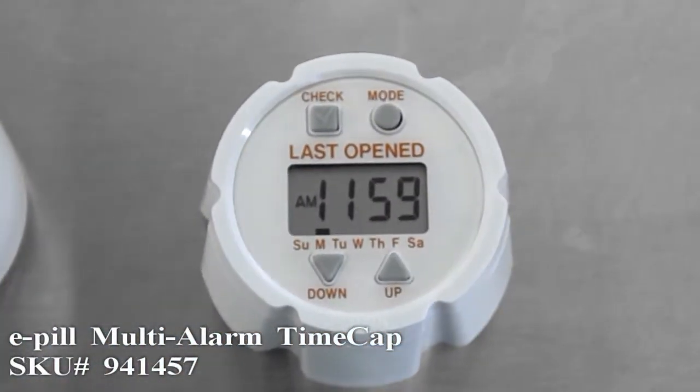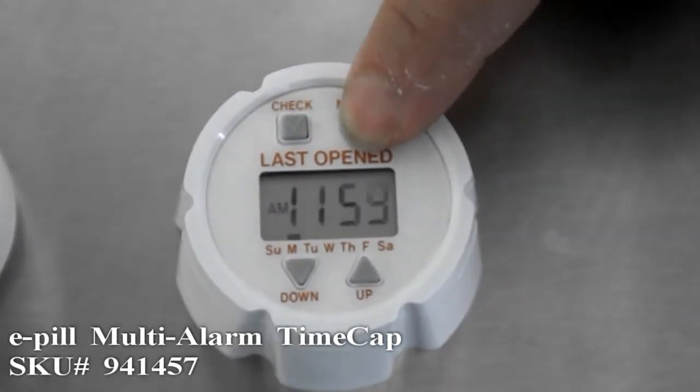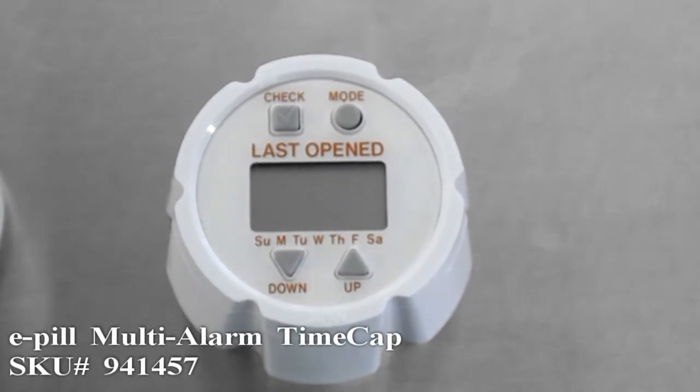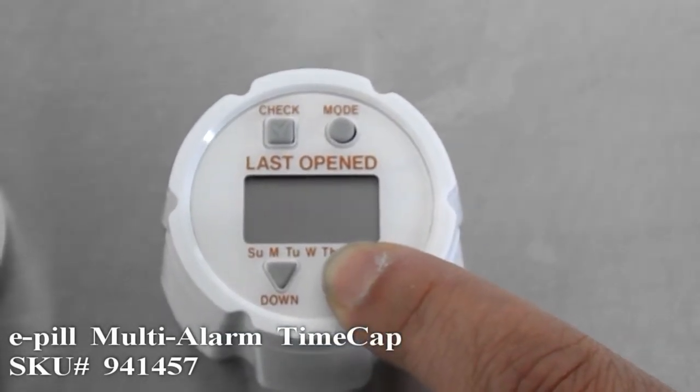We will set the time to 2:30 p.m. Tap the mode button so the time begins to flash. Then use the up and down arrows to change the time. We will press the up button to get to 2:30 p.m.